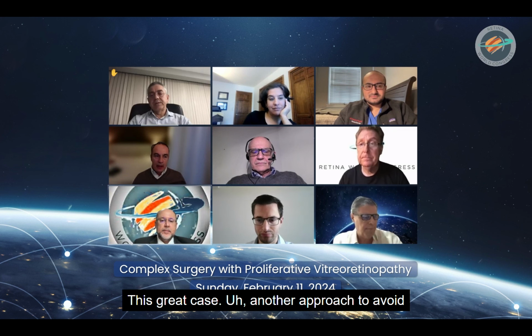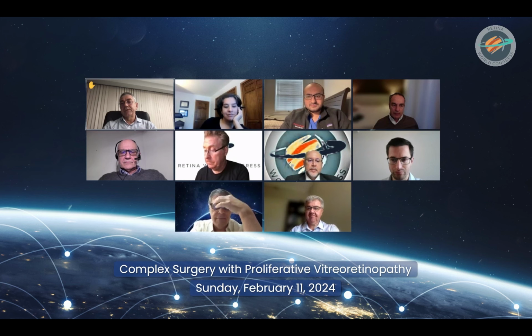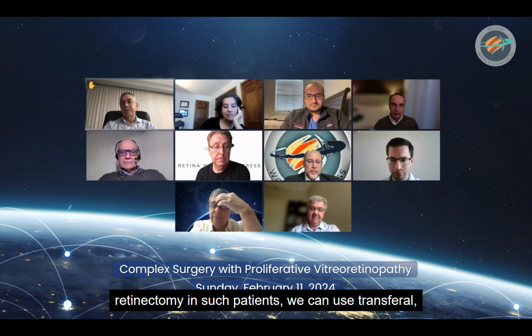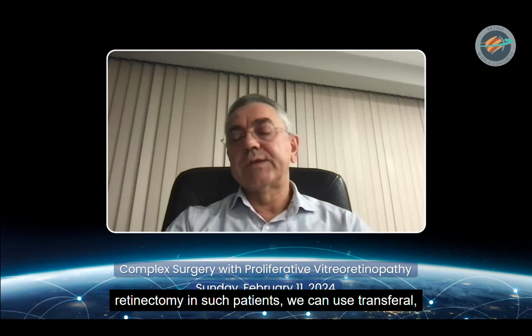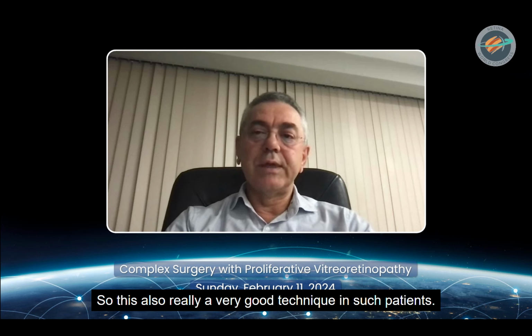This is a great case. Another approach to avoid retinectomy in such patients, we can use a transcameral approach, transcameral removal of subretinal band, like Khalid Sabti from Kuwait introduced this technique several years ago. So this is also really a very good technique in such patients.